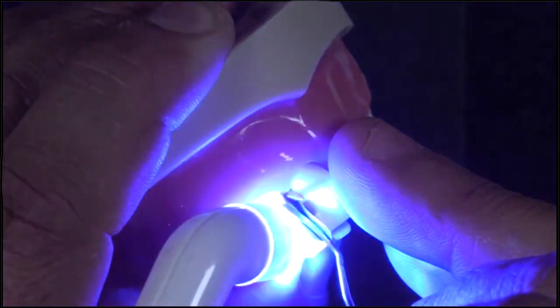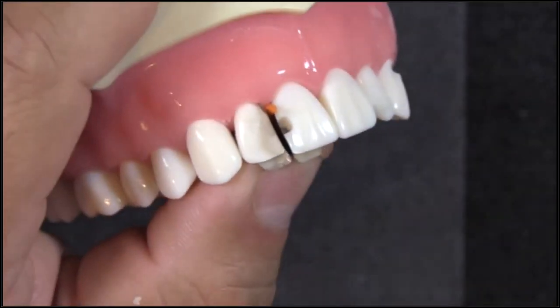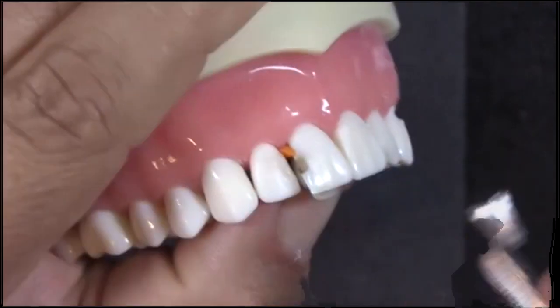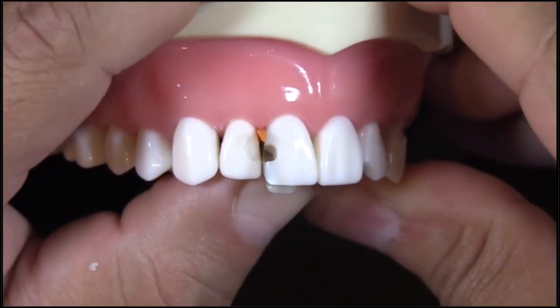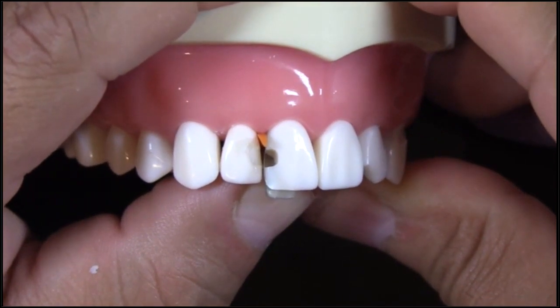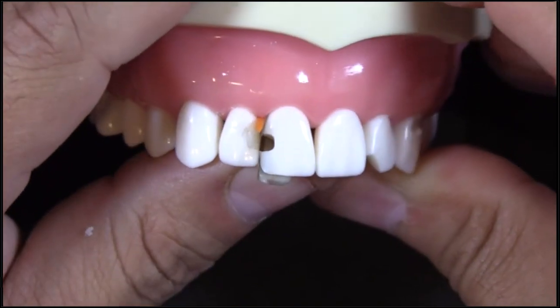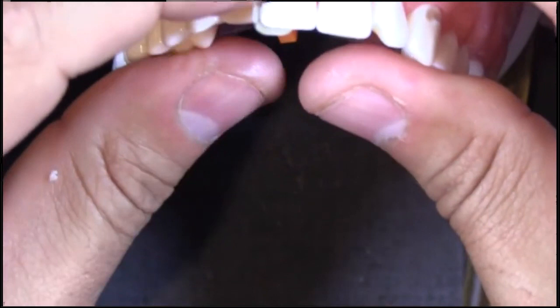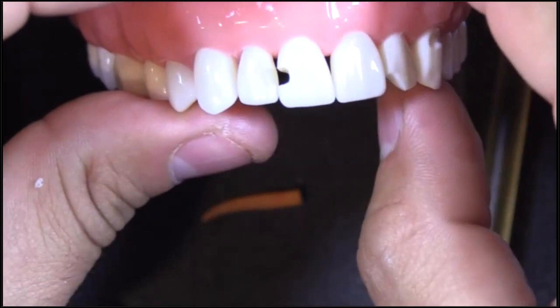Then what we're going to do is remove just that one matrix band, leaving the other one in place. You can see that the contour is pretty spot on with where we want it to be — really happy with that. We would do the exact same thing for this restoration here. It's just a great way to restore these types of restorations — really nice curvature.